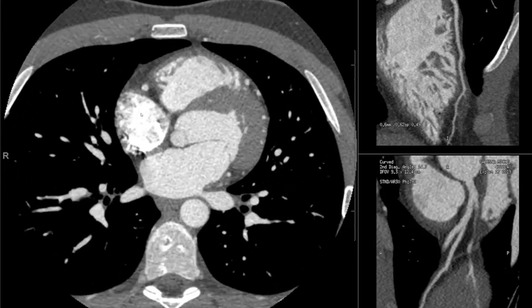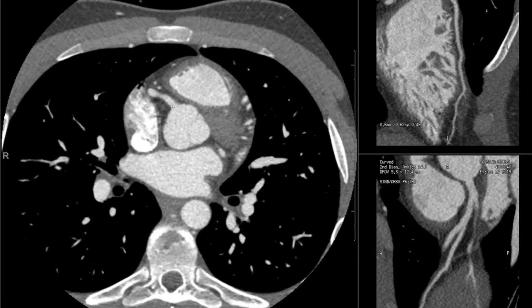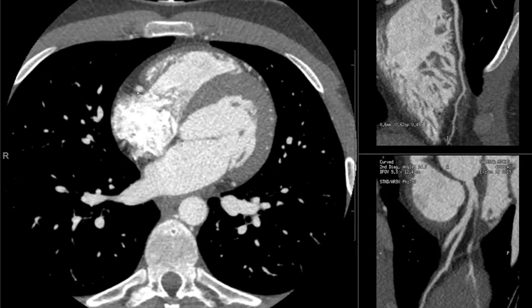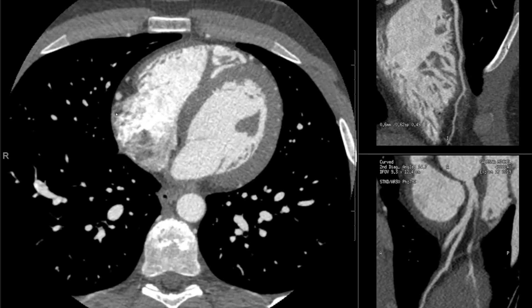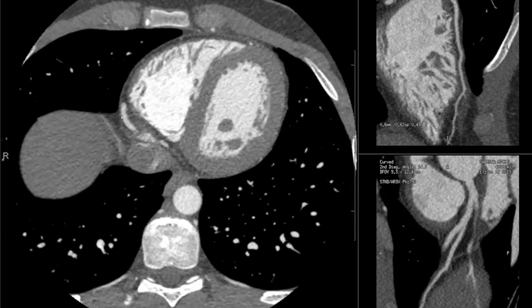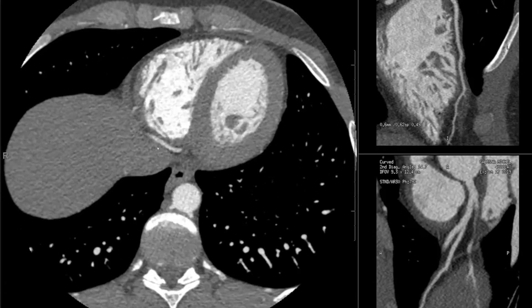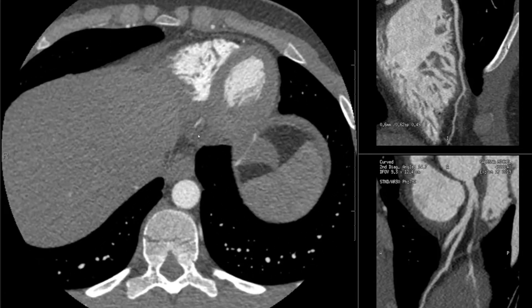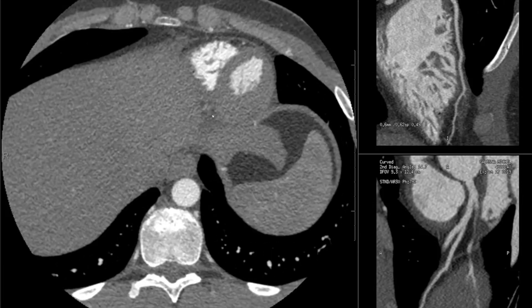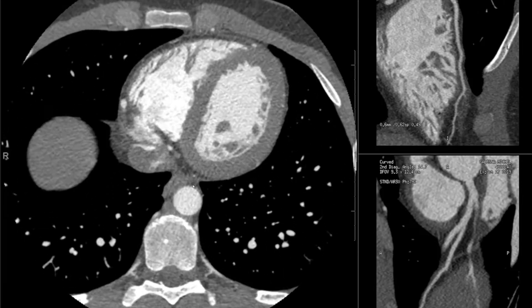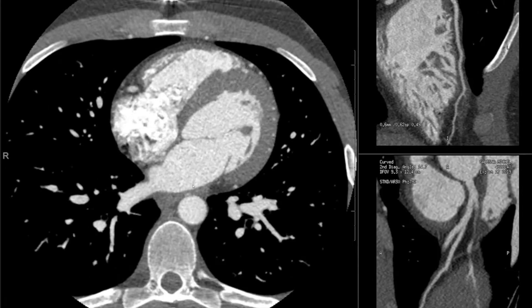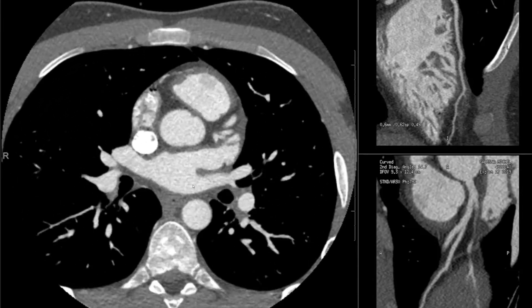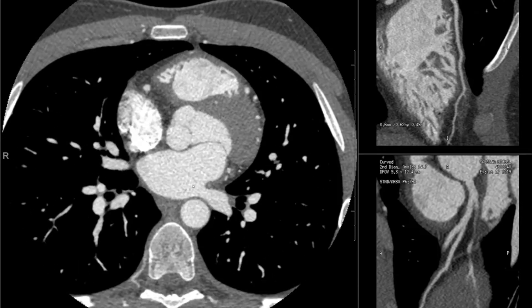Proximal RCA — no plaque, no stenosis. Mid RCA also free of plaque and disease. Distal vessel widely patent, no plaque, no stenosis. Our posterior descending artery is unremarkable. Based on these images, it's pretty clear that there's no evidence of any coronary artery disease to explain the patient's chest pain and troponinemia.